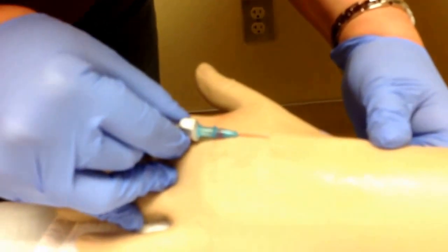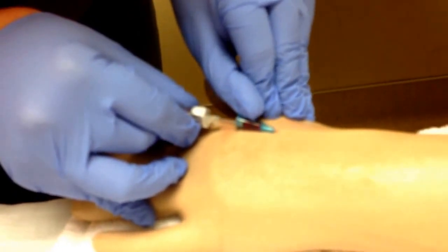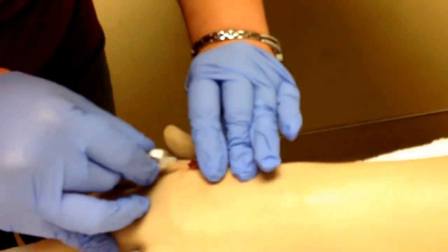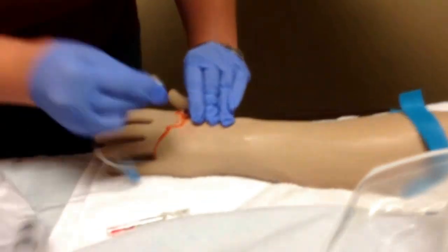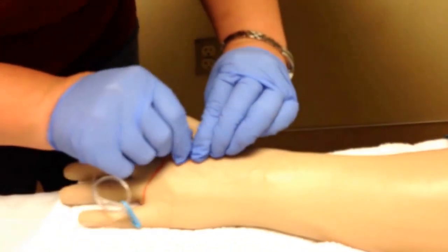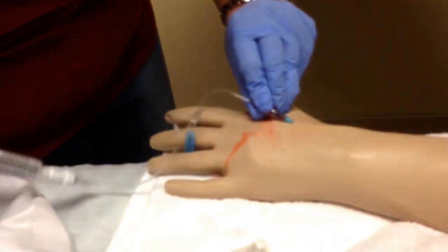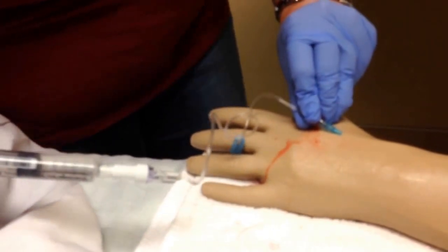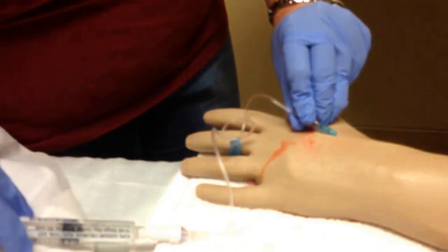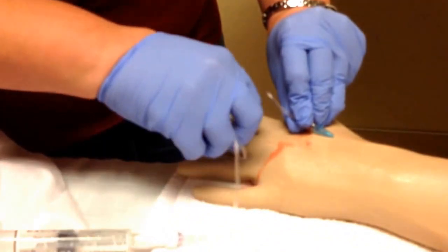I have a flash. Once I see the flash, I'm going to advance my catheter off the needle. I'll release my tourniquet, hold pressure, activate my safety, and attach my lock. I'll keep hold of my catheter and flush it. It should flush easily. If it doesn't flush easily or if it infiltrates, we don't want to continue flushing — we would discontinue this IV and start a new one.